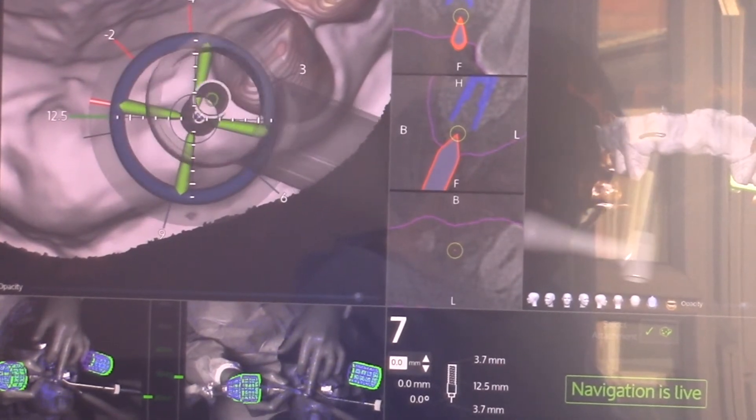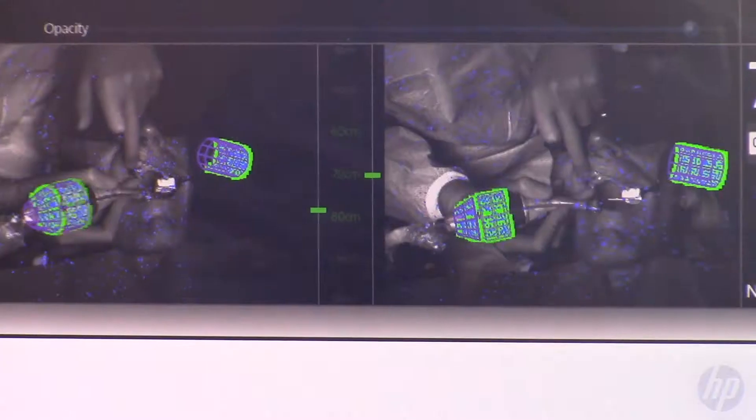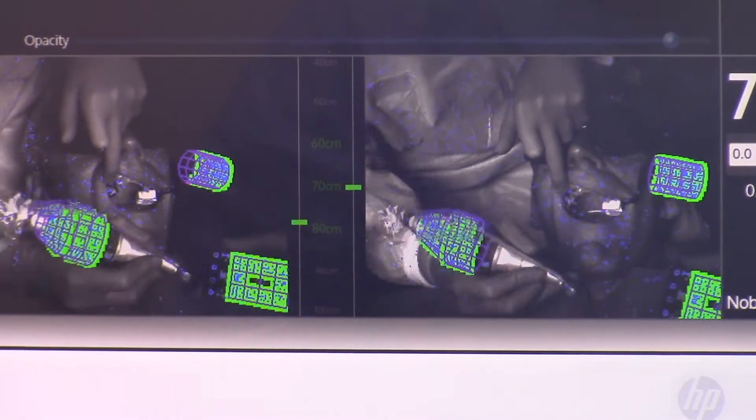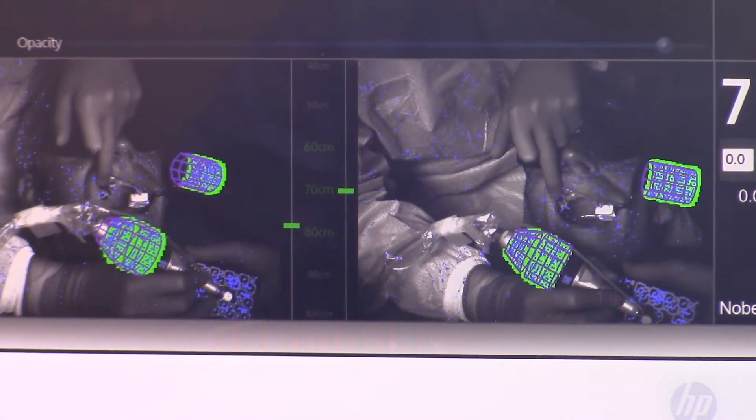I can see the position of my drill against the soft tissues and its distance from the bone. I can see my angulation and check that I'm drilling in the same position as I've pre-planned on my DTX software.